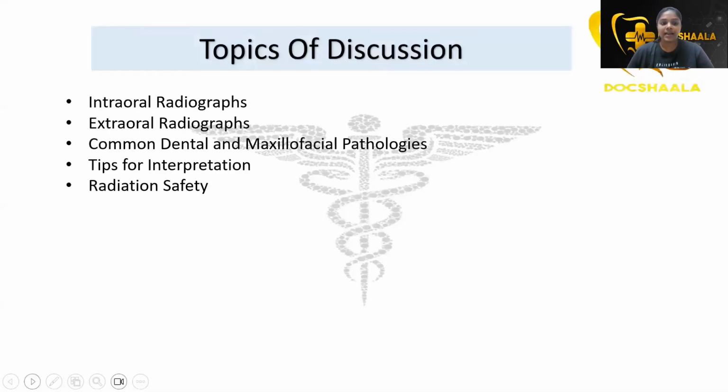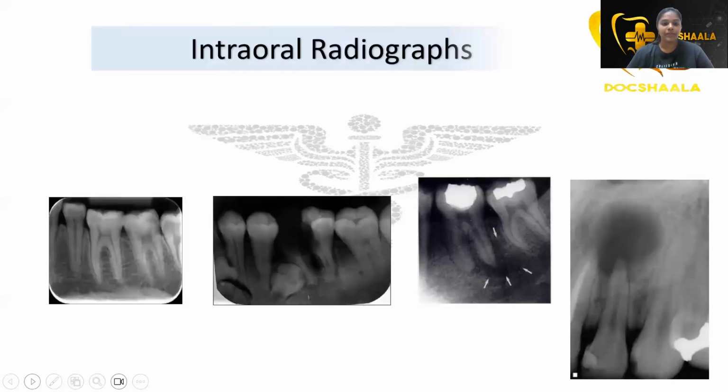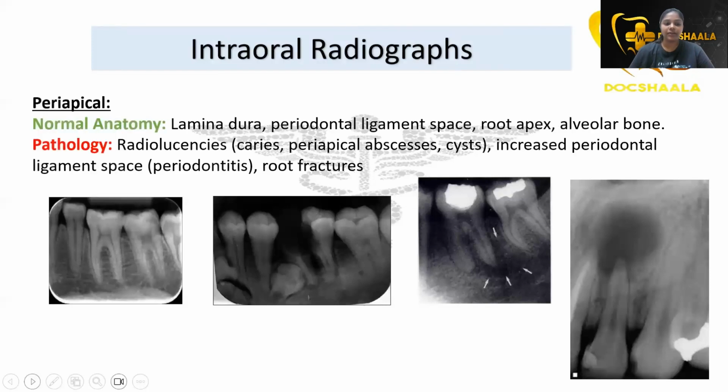We'll discuss intraoral radiographs, extraoral radiographs, and common dental and maxillofacial pathologies, those we are well versed with. Okay, and tips for interpretation, and also a few points on radiation safety. Okay, so let's see intraoral radiographs.